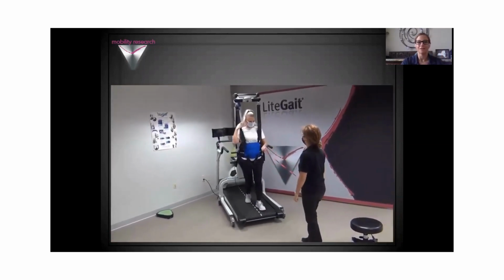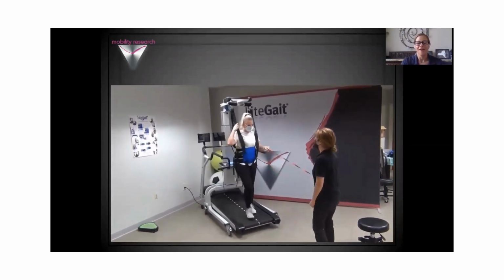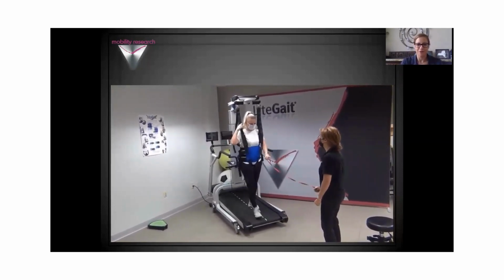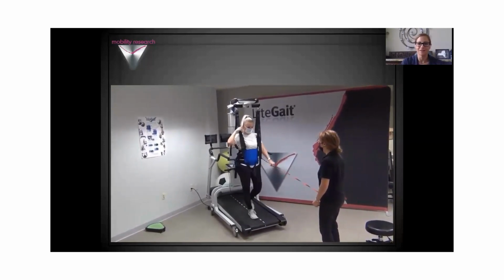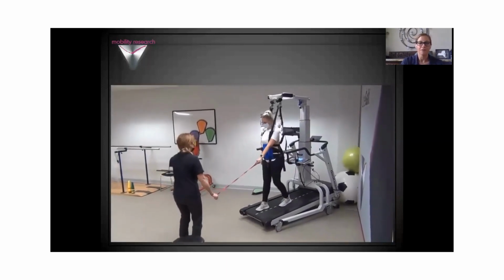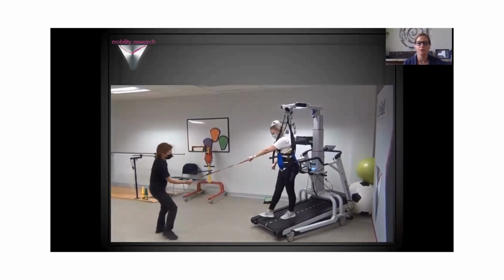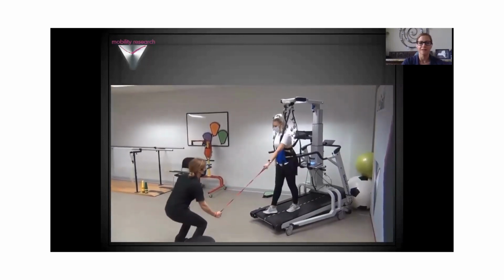This client is working on downhill walking while my colleague is pretending to be her puppy and pulling to create some balance perturbations in some different conditions. So that one of this client's goal is to be able to walk her dog again. And so again, some very task-specific practice. You can see that free dome yoke is open, the flexible yoke is open, so she's got some bounce as well as the ability to rotate. So the LiteGait is really just there as kind of a safety tool to prevent her from falling and get her more comfortable with the task.